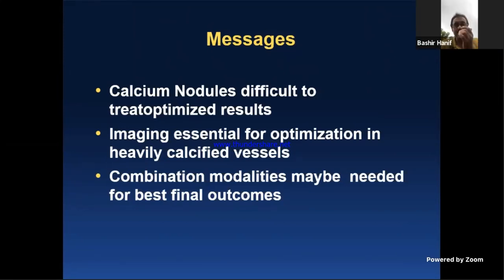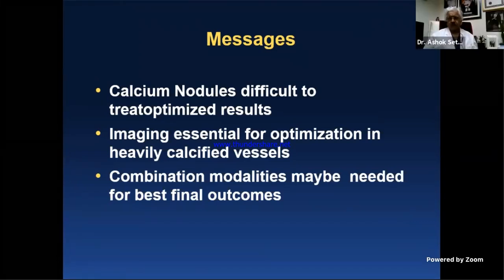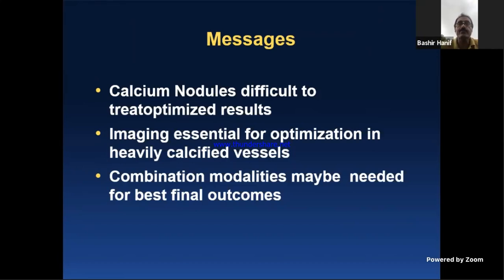Can I say something, Ashok? I think an outstanding case is no doubt. The traditional teaching in the past had been that if there's a dissection, then you should avoid rotational atherectomy. And now we are doing it even up like halfway atherectomy and balloon burst. Up to what extent of dissection is going to inhibit you from proceeding with the rotational atherectomy? Brief answer. It doesn't bother us. Brief answer is that. Okay, good. Getting the lesion open is more important.